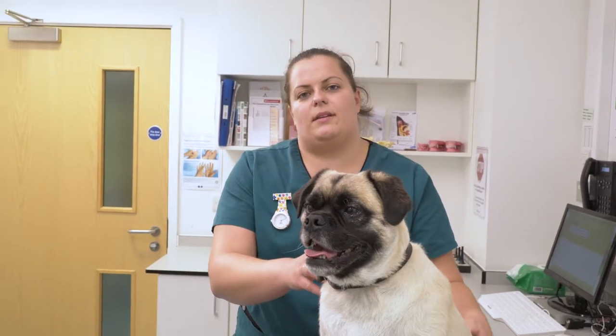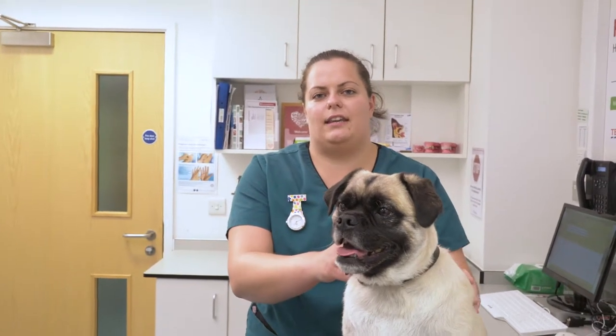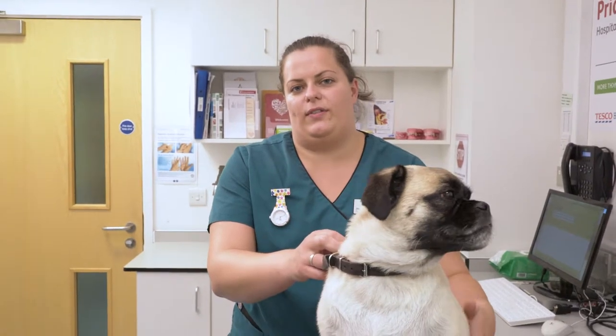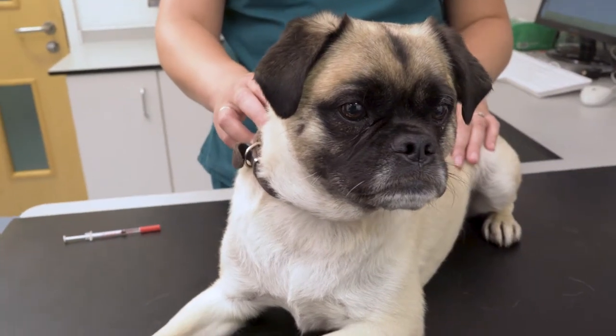This is Bailey and he's going to help demonstrate how to give a subcutaneous injection, so under the skin. This is a recap following on from the consultation with your vet. There may be a number of reasons why you've been asked to give your pet an injection. The main two are if your pet is diabetic or if they need allergy injections.